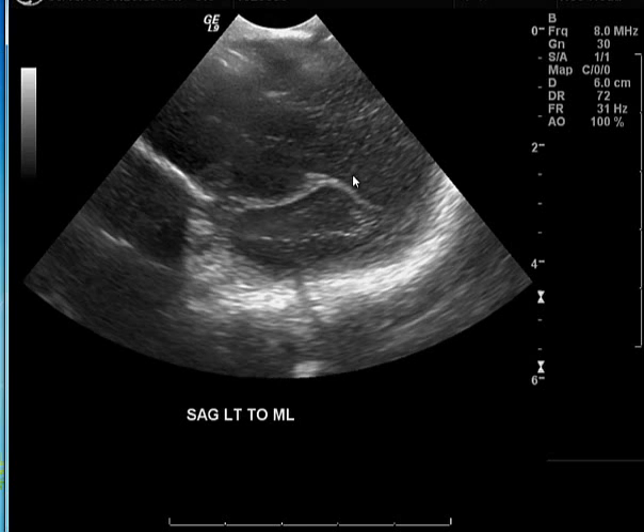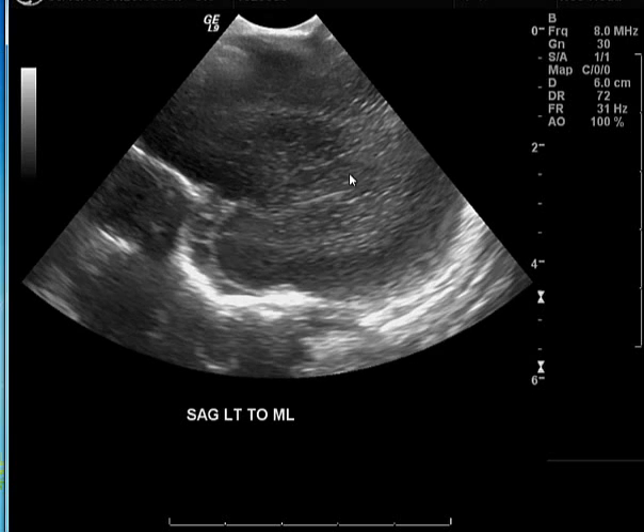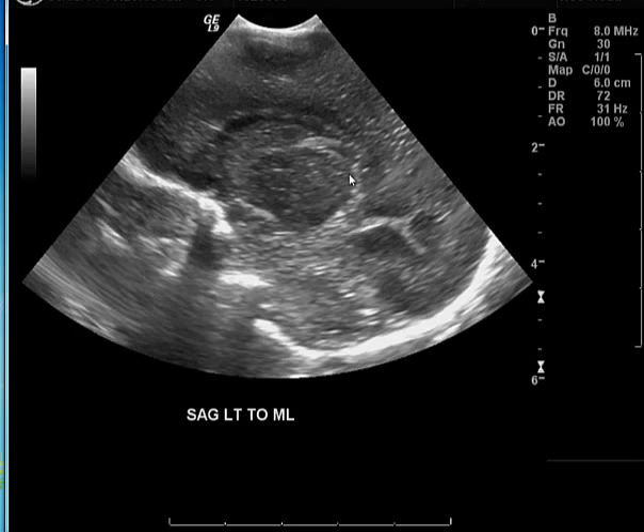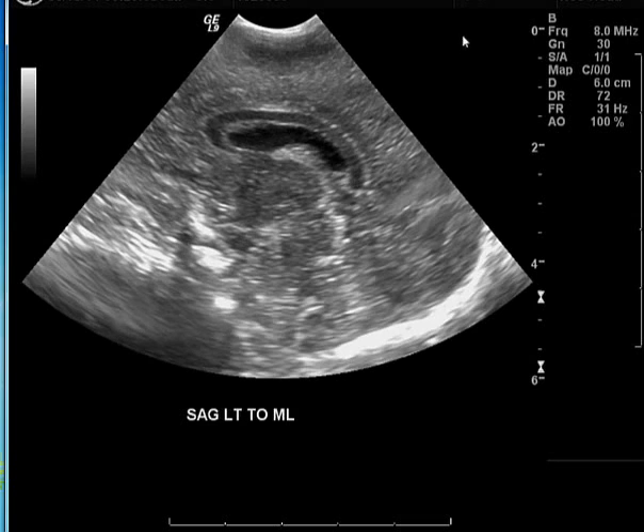Moving on, these are now the parasagittal images from the left toward the midline — the same findings as the right-to-midline images, with a similar appearance seen from the left side of the midline. These images look pretty normal as well.